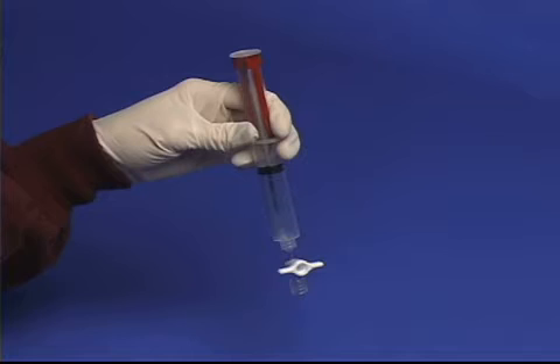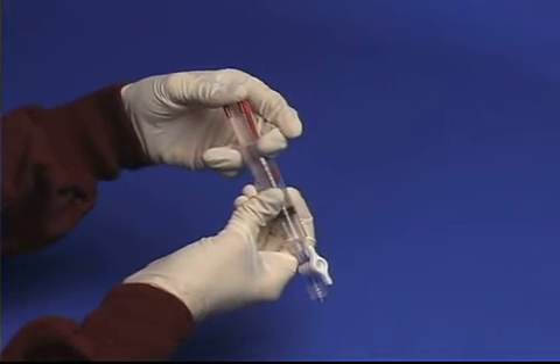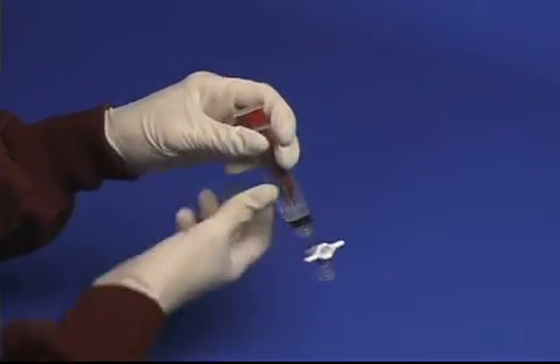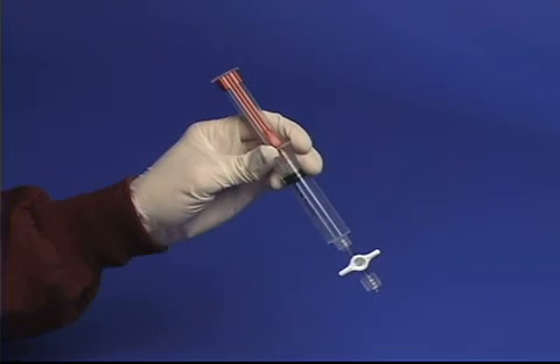Begin by preparing the syringe. With the stopcock in the open position, depress the two plunger locks and fully advance the plunger into the syringe. Turn the stopcock 90 degrees to the closed position and pull the plunger back until it is locked in place at 10 cc, creating suction.